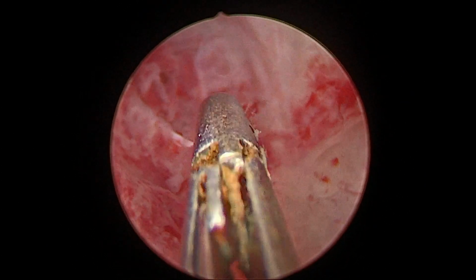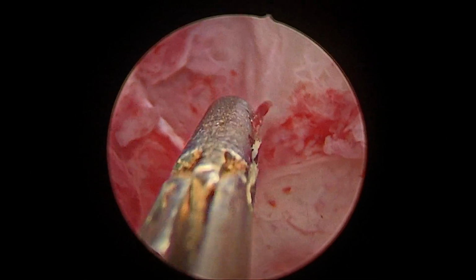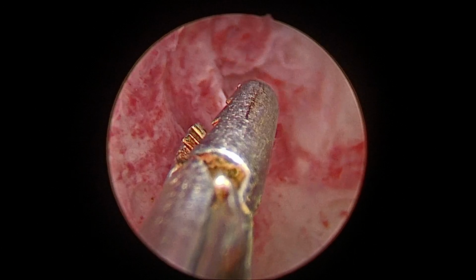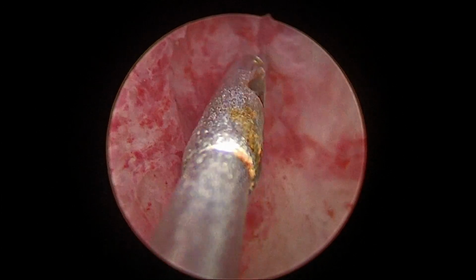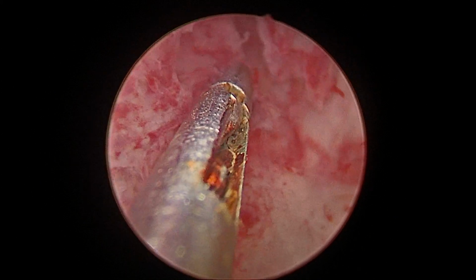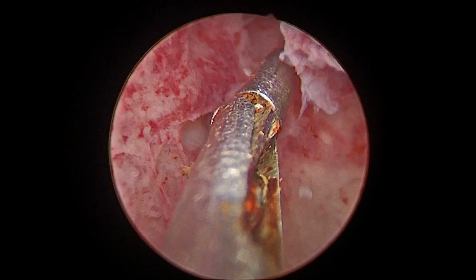and later when we did the check hysteroscopy finally, we could see a piece of thread that was looking embedded inside the endometrium near one of the tubal ostia, which was not easily coming out.